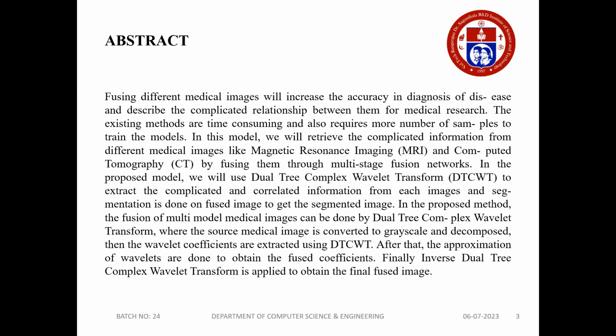Coming to our abstract, in this proposed model we try to fuse different medical images to increase the accuracy in diagnosis of disease and describe the complicated relationship between them for medical research. In this model, we'll retrieve the complicated information from different images like magnetic resonance imaging and computed tomography by using them through multi-stage fusion networks.